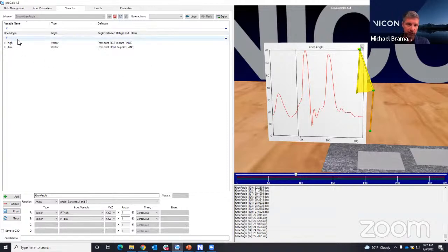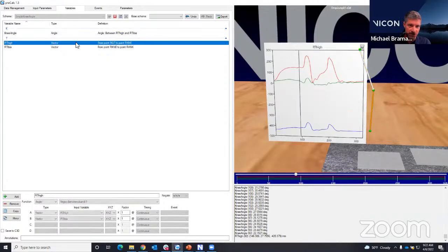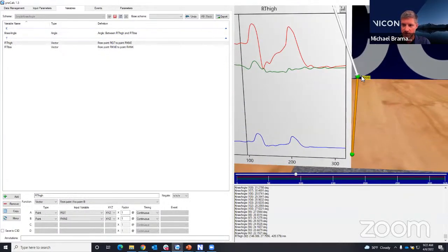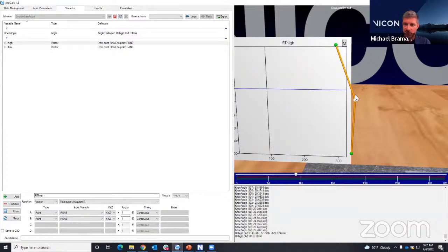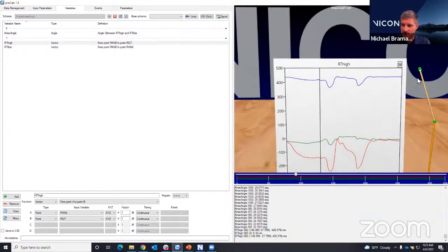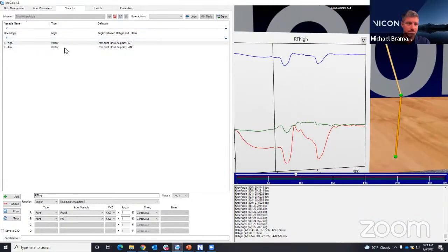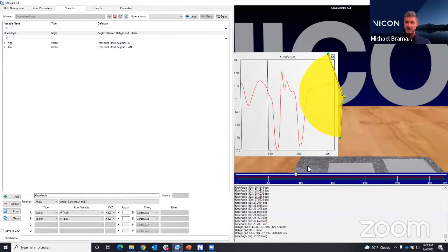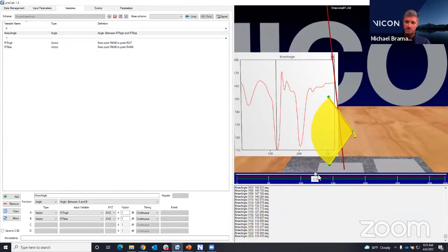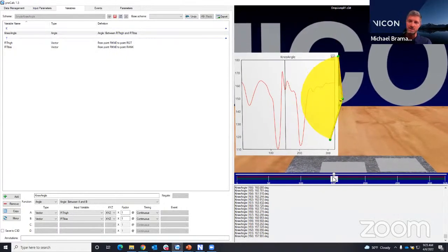If I keep in mind that it'll typically put the actual angle at the tail end of the first vector, you can actually go in here, and I don't know if you guys noticed this, I didn't point this out, but there is a little arrow there that shows you the direction of the vector. But I can easily change this. So if I go back to that right thigh vector, I can select the right knee and then the right greater trochanter, and you can see that vector direction has changed. Now if I go back to my angle, there we go. So now I have an angle that is similar to what I had in that PowerPoint slide.